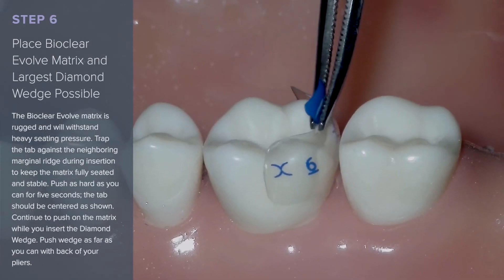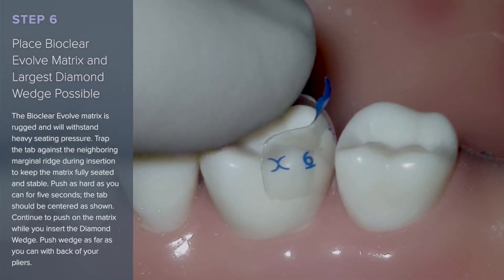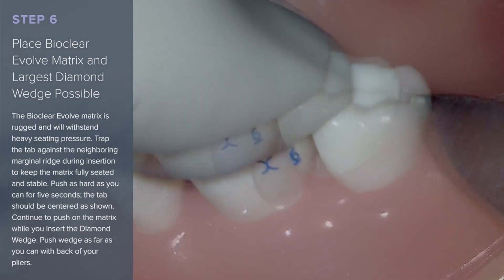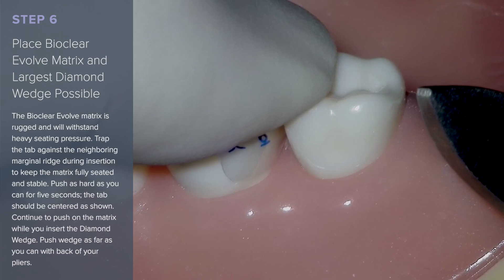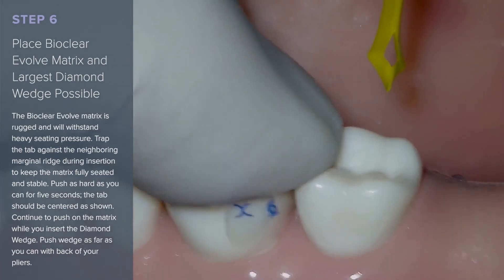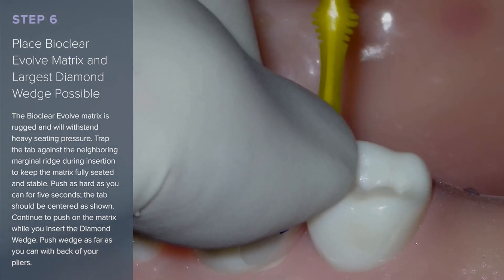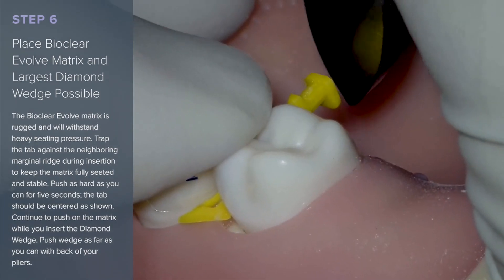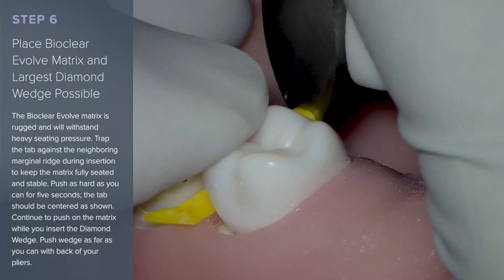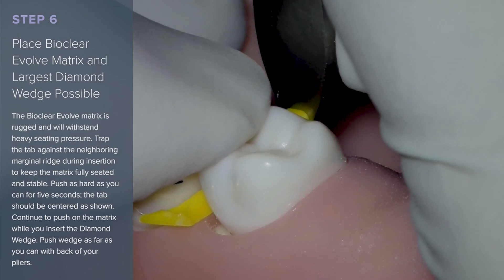The Bioclear Evolve Matrix is rugged and will withstand heavy seating pressure. Trap the tab of the matrix against the neighboring marginal ridge during insertion to keep the matrix fully seated and stable. Push as hard as you can for 5 seconds to fully seat the matrix. The tab should be centered as shown. Continue to push on the matrix while you insert the diamond wedge. Push the wedge as far as you can with the back of the cotton pliers once it has been inserted.